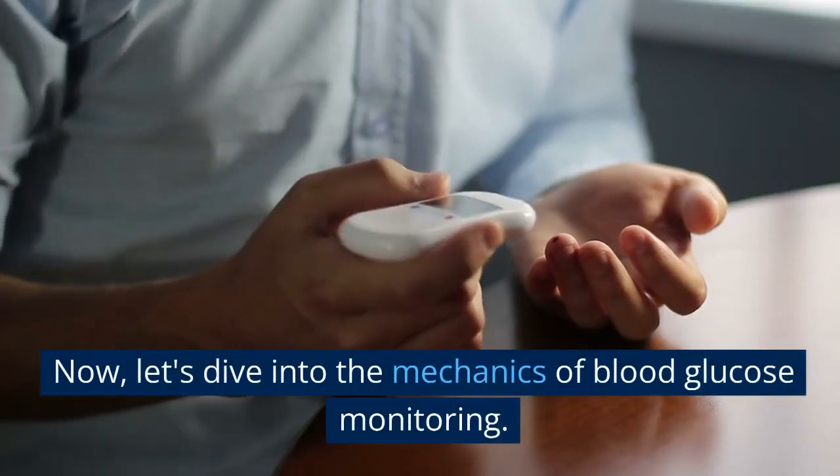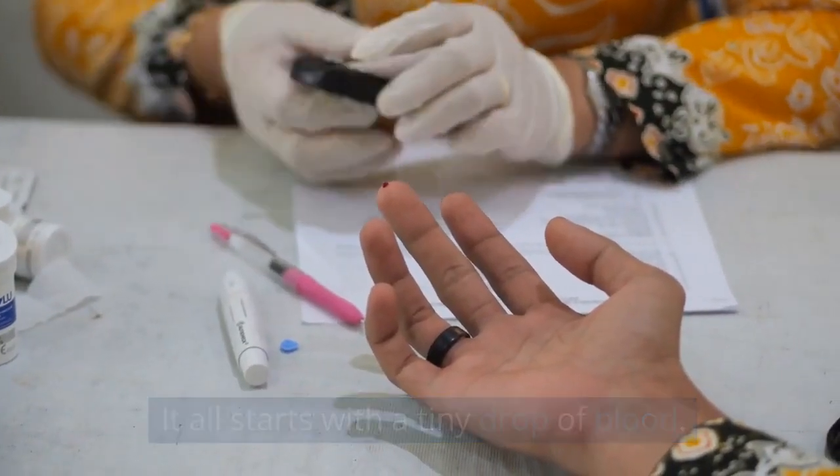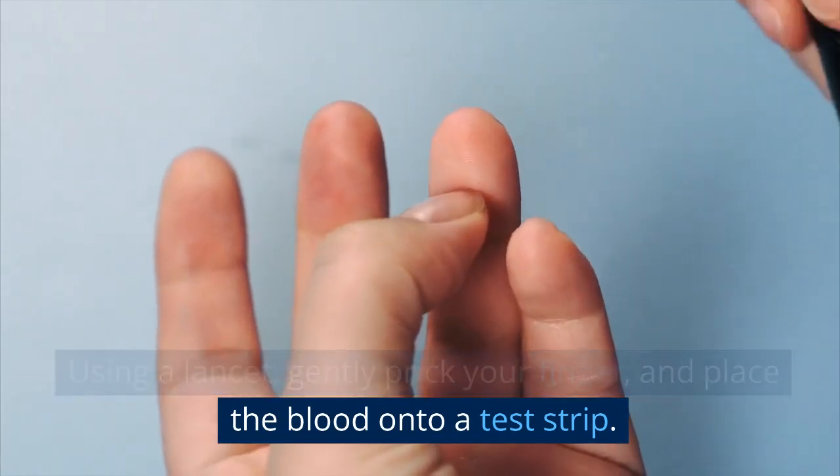Now, let's dive into the mechanics of blood glucose monitoring. It all starts with a tiny drop of blood. Using a lancet, gently prick your finger and place the blood onto a test strip.